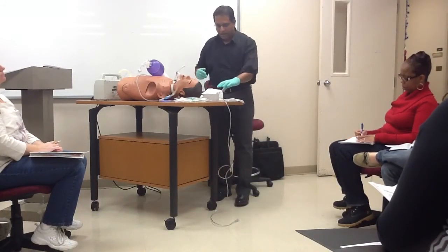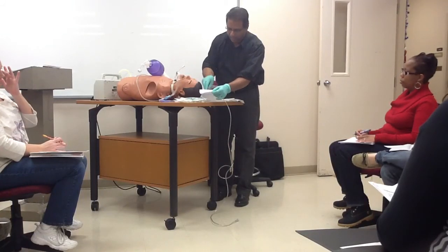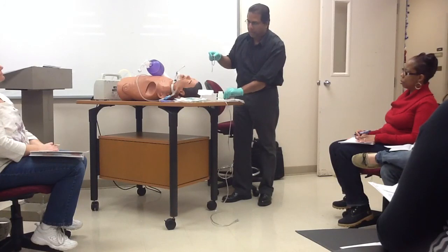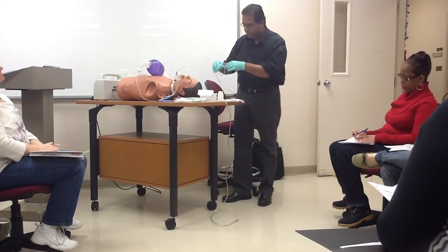All right, now, I got the right size of suction catheter. Well, I got the lube here already. Lube it up.